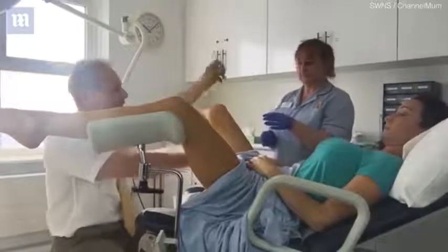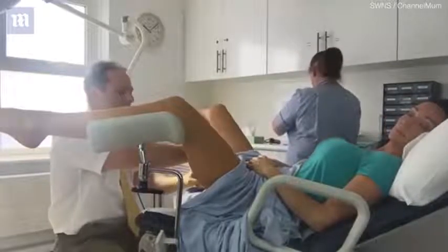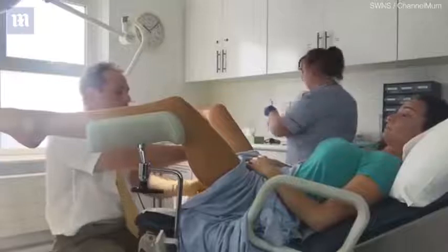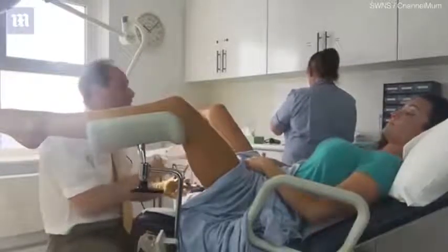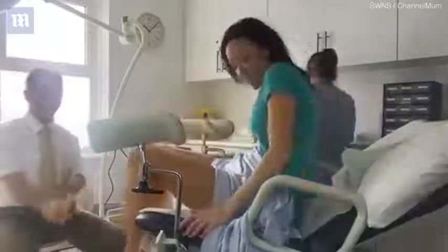So that's finished. That goes into the specimen, and Marlene shakes that around to get the cells off, and then we literally remove the speculum. And that's the smear test complete. Well, job done. That was as easy as they get.